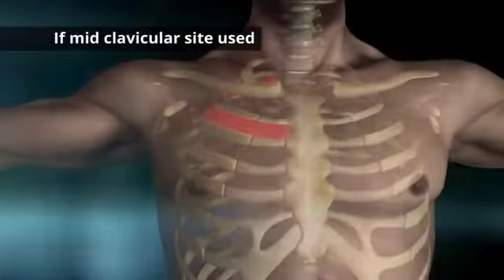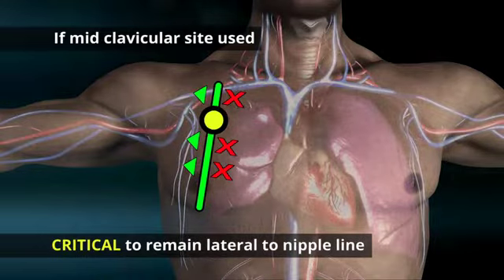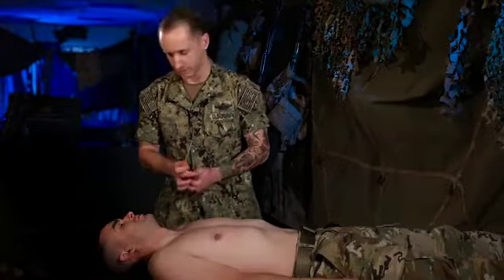If the anterior MCL site is used, it is critical to remain lateral of the nipple line to avoid the heart and large blood vessels. Once I've identified my site, I'm going to remove the needle catheter. Remember, it's 14 or 10 gauge, 3 1/4 inch.